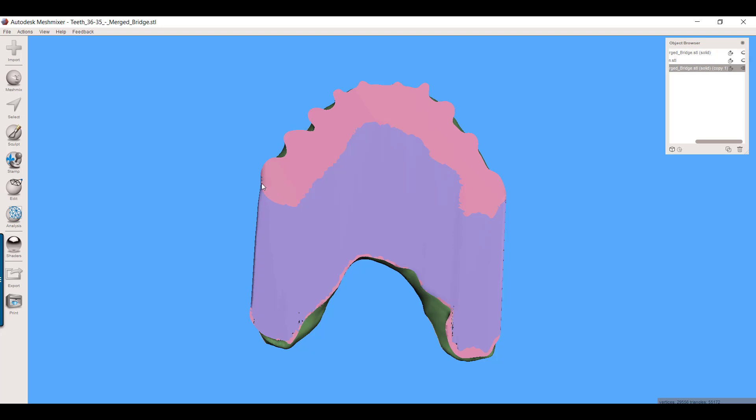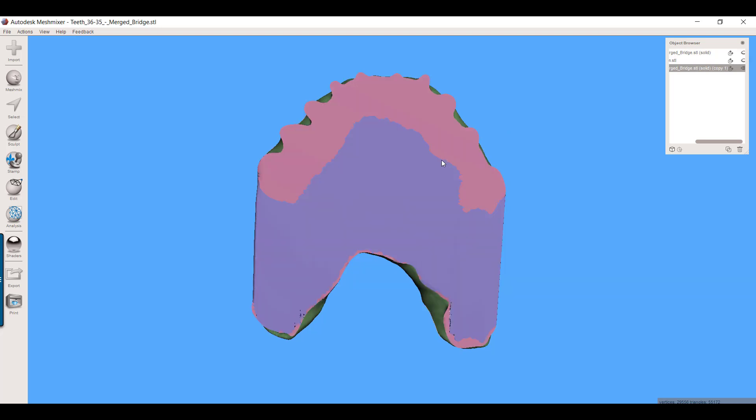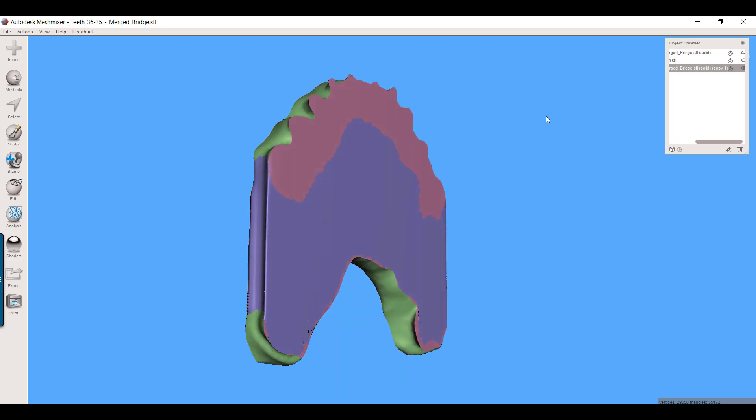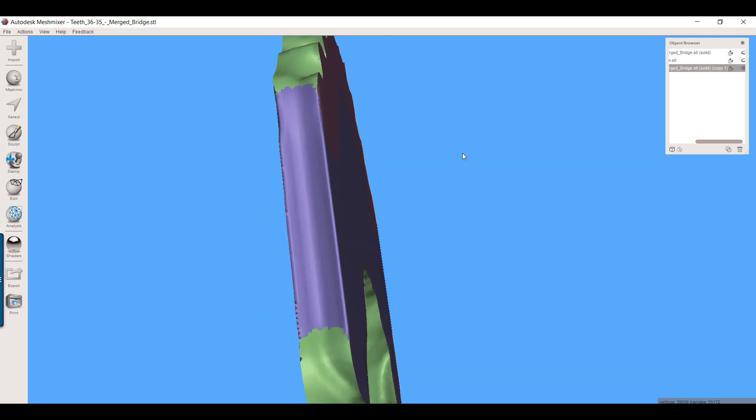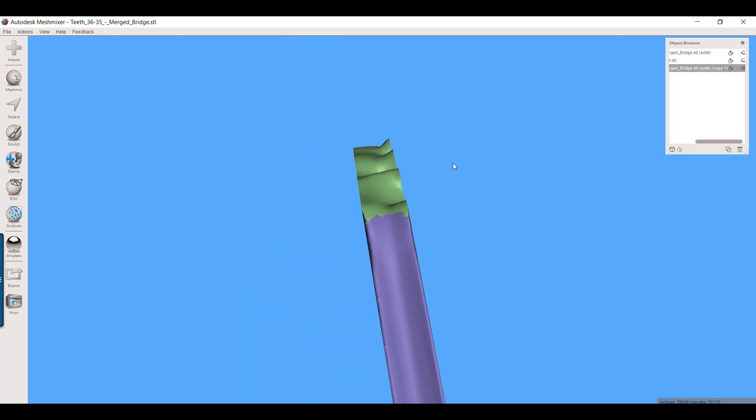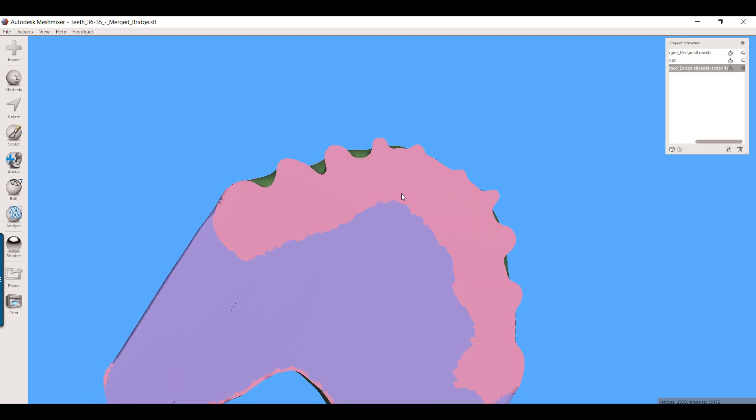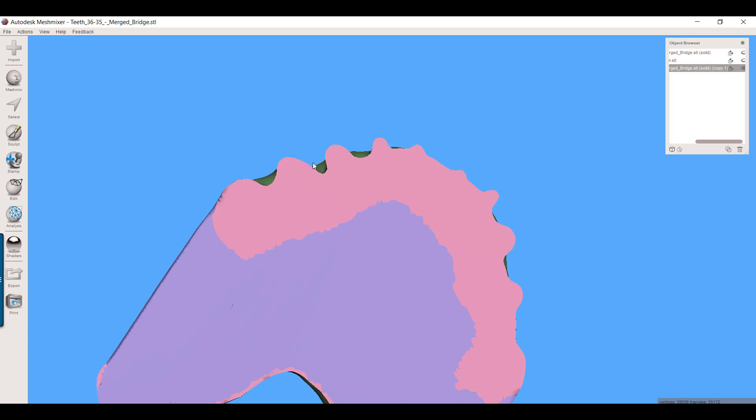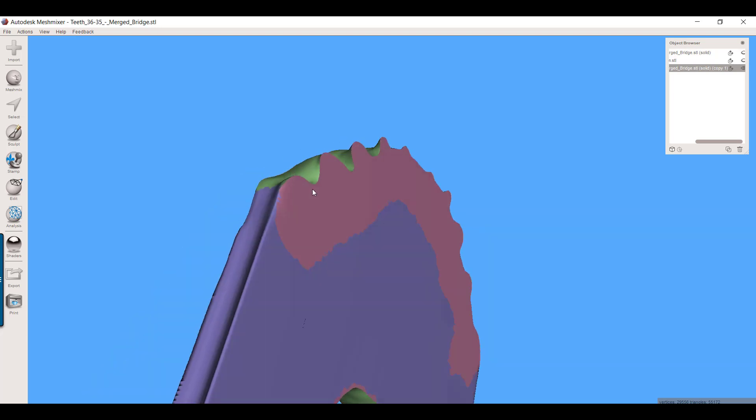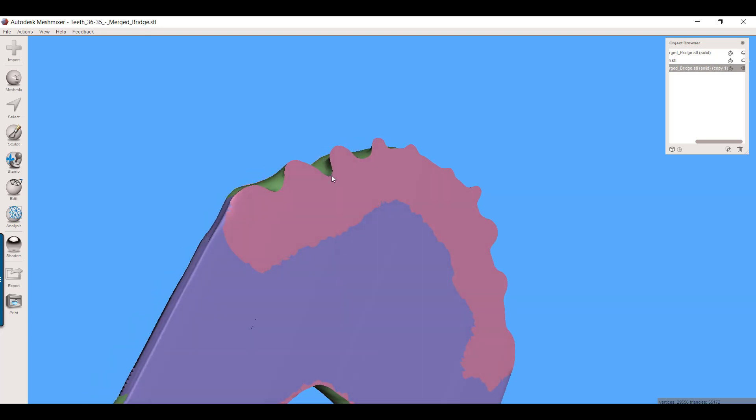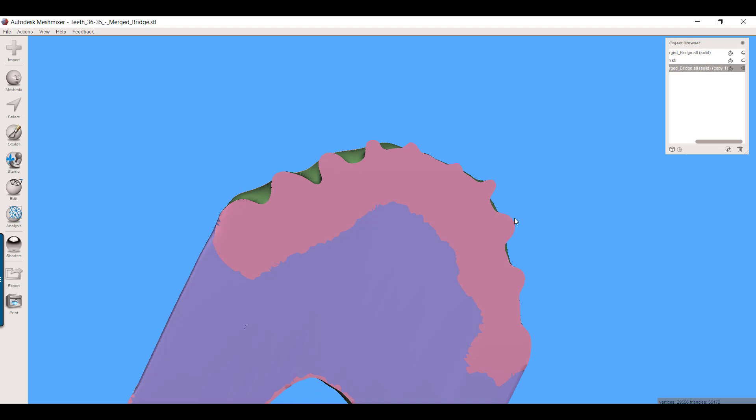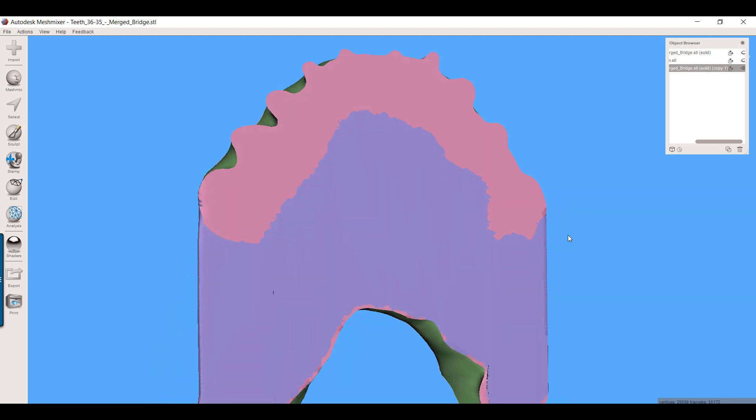You can just take a pencil and trace along this front edge, and then cut your Trilor bar to exactly that shape. Now where you have this undulation right here, you're not going to be able to replicate that in three dimensions. So what I'd suggest you do is before you do your tracing, you don't have to have all these little finger extensions. Just take a handpiece or your model trimmer and just trim this back flush to whatever the deepest surface is. That's going to give it a much more rounded profile, much easier shape to trim.